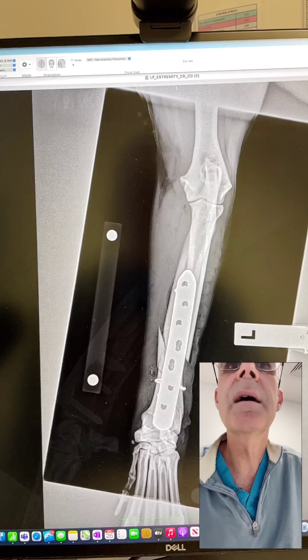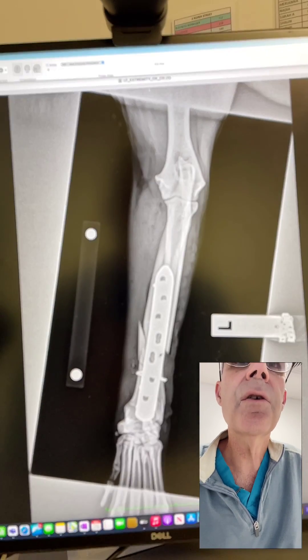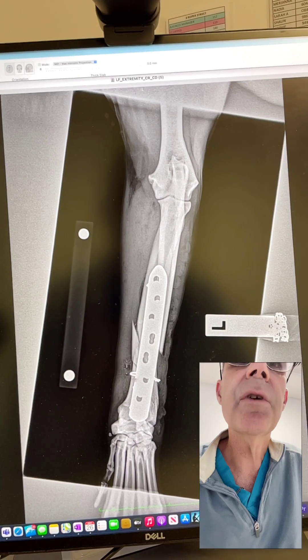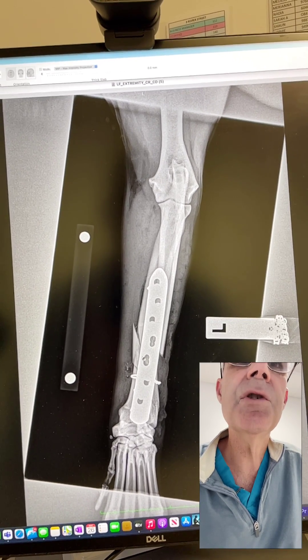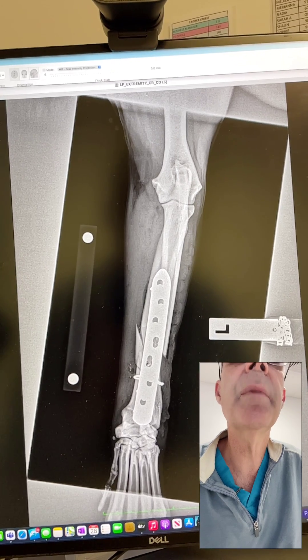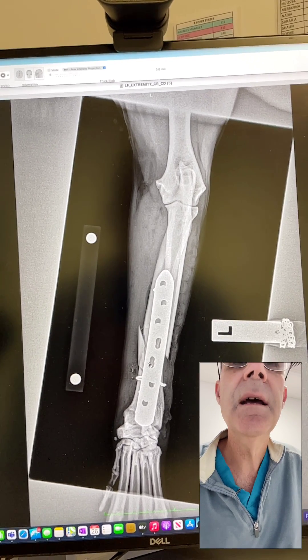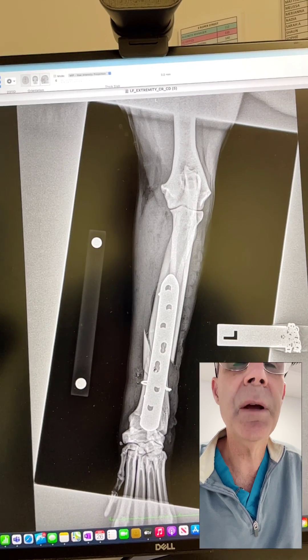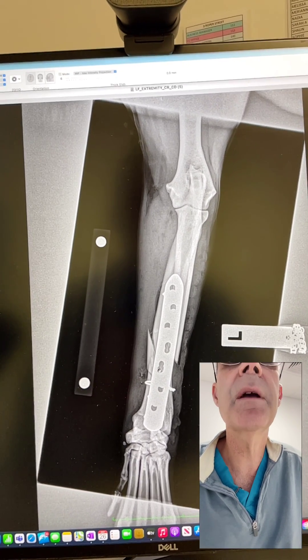Looking at my cranial caudal view, we've got really nice alignment proximally and distally. We've got our cerclage wire in place. We can see that we've got comminution there and we haven't completely reduced that comminution, which is fine. We've done more of a biological repair rather than a biomechanical repair.